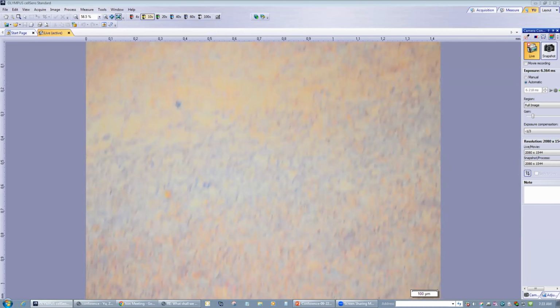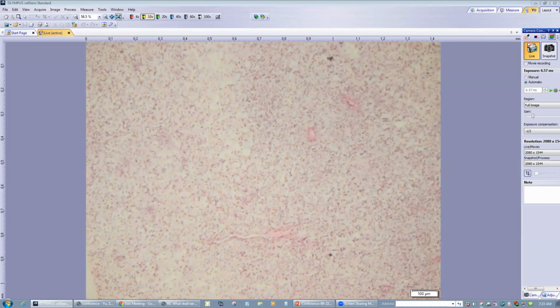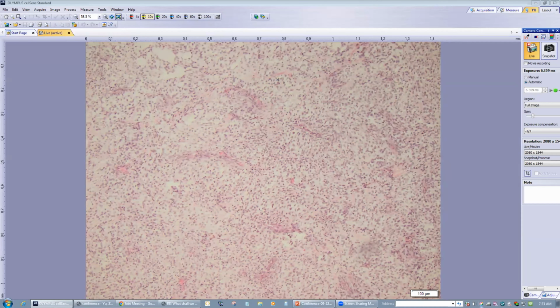Go over the whole tumor. There is some degeneration. Let's do that area. That appears vessel part more. Appreciate the vessel is getting better. So the vasculature, just like if you do myxoid liposarcoma, they call chicken wire vessels. This is also in this kidney tumor called the clear cell sarcoma of kidney. So it's another feature. Immunohistochemistry in the past usually did not help much.